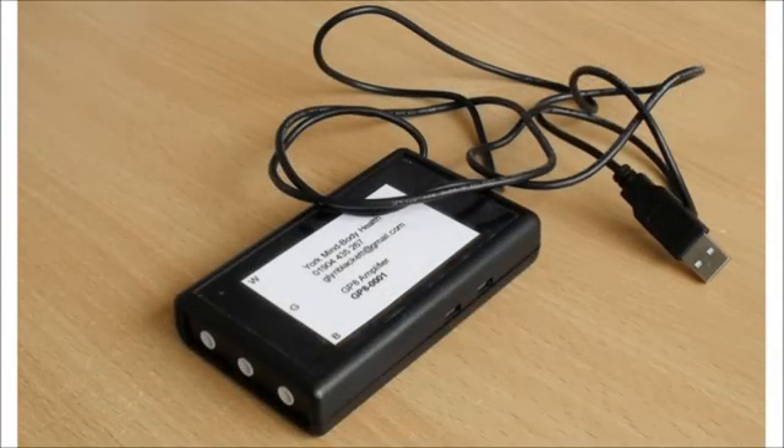The GP8 connects to the computer via its USB cable here. You don't need to do any driver installation for this device. Just a word about care: please be a little delicate with the cable. Don't tug on it, don't coil it too tightly, and don't coil it around the GP8 box.